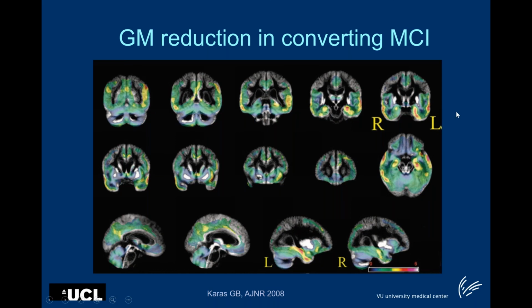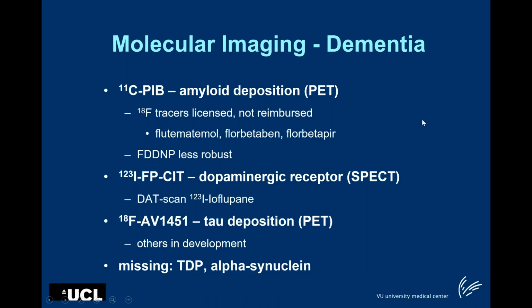The regions that are most predictive, as you would expect, are in the hippocampus, but in fact also more lateral temporal regions already, consistent with the plots of the nonlinear registration that I showed you previously. So the more atrophy you develop, the more likely you are to convert, of course.